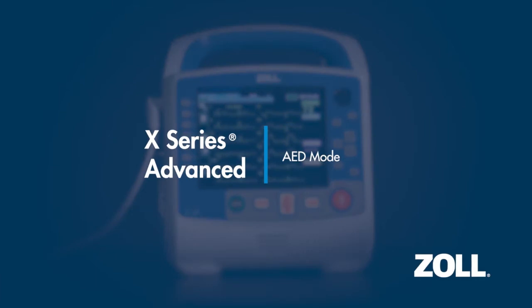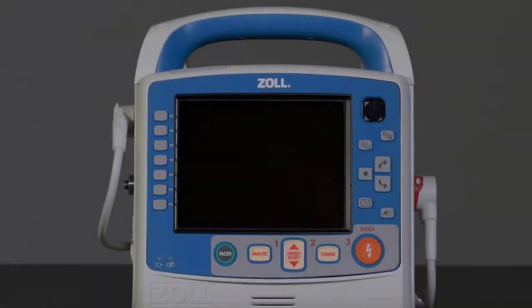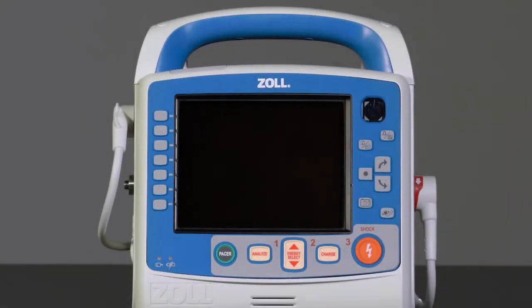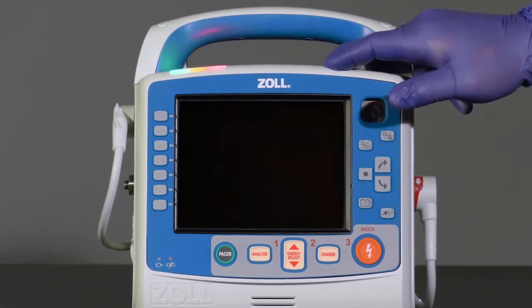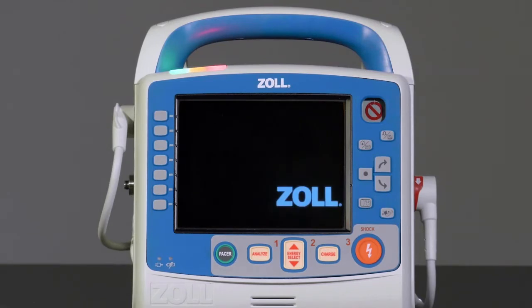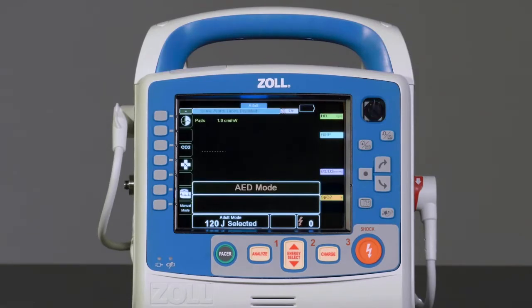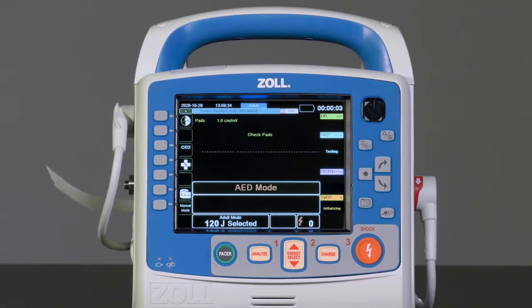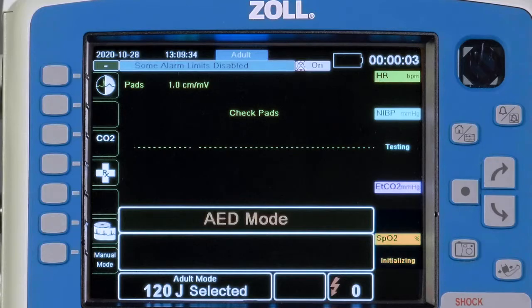AED Mode. The X-Series Advanced can be configured to startup in manual or AED mode. In AED mode, an analysis CPR protocol guides you through a cardiac event by performing ECG analysis, preparing the device for a shock if needed, and guiding you through a CPR interval.